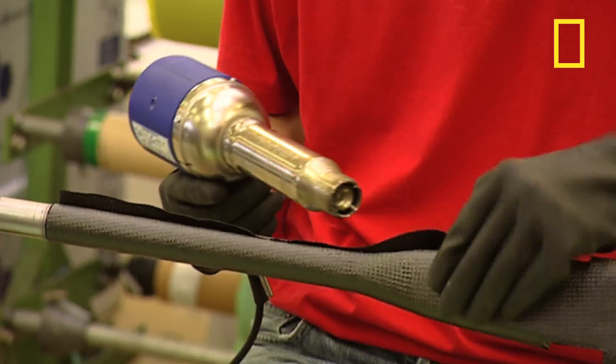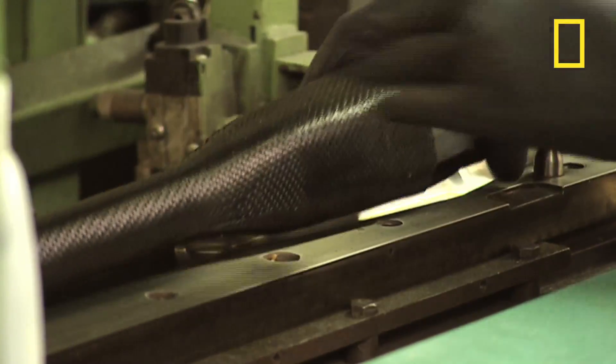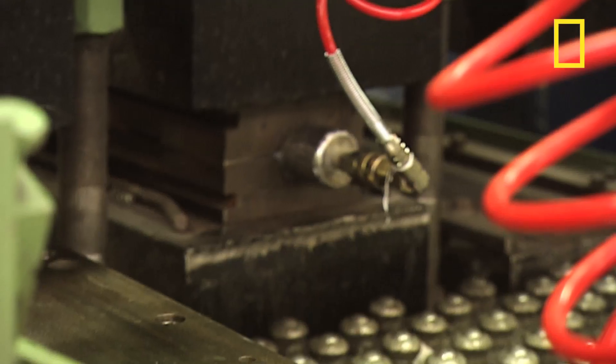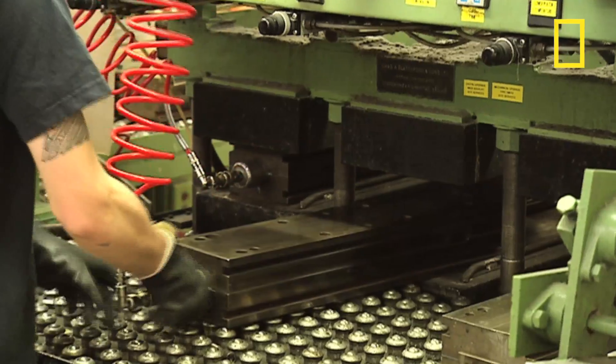Next, the shin is manufactured from carbon fibre, the kind of stuff you normally find on supercars. After it's been laid out, the sheet is baked under immense pressure for 90 minutes. This compresses the layers of carbon fibre into a thin, light but immensely strong structure.